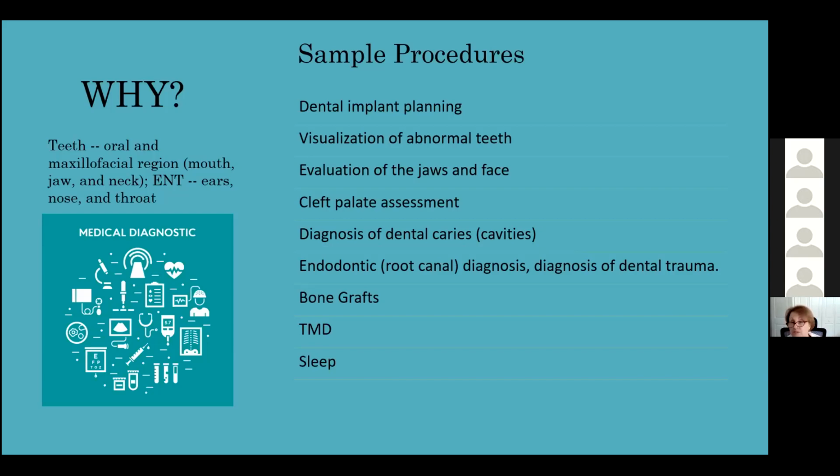That's another option. Cleft palate assessment, even carious lesions that have transmitted within the oral cavity. And we absolutely need to look at the transmission of infection, because cavities are an active infection and cause the need for root canal or diagnostics.